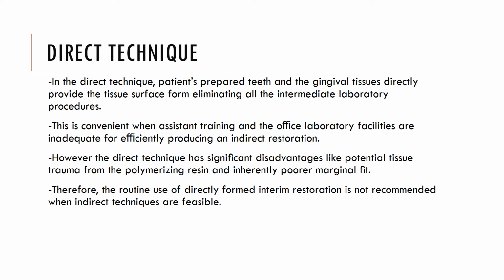Coming to the direct technique. In the direct technique, the patient's prepared teeth and the gingival tissue directly come in contact to provide the tissue surface form, eliminating all the intermediate lab steps. This is convenient when assistant training or office or lab facilities are inadequate for efficiently producing an indirect restoration.